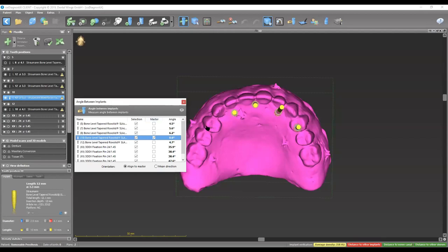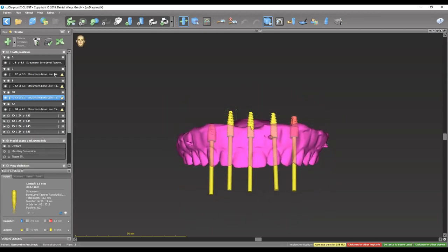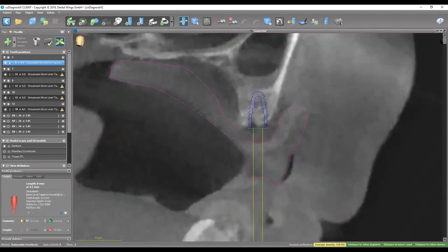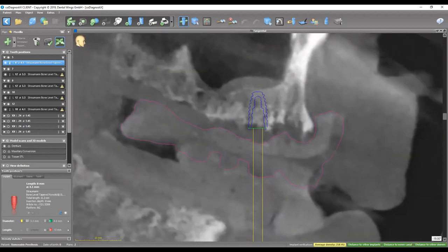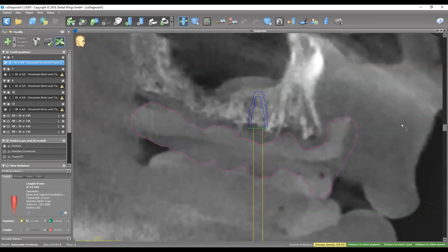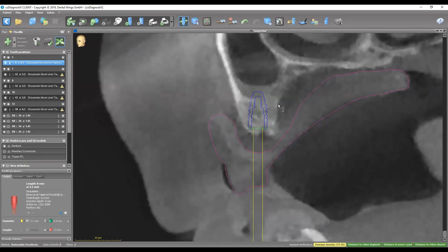Going over each implant site starting with the right side: we placed a 4.1 by 8 millimeter implant. The reason for an 8-millimeter implant is because there's pneumatization in the sinus and we can't place it deeper. What I would do here is place the implant virtually just a millimeter shy from the floor of the sinus, then clinically do a very mini sinus bump approach — bump the sinus and place the implant at a more apical position without even grafting. After the sinus bump, the apex ends up about 1 to 1.5 millimeters into the sinus.